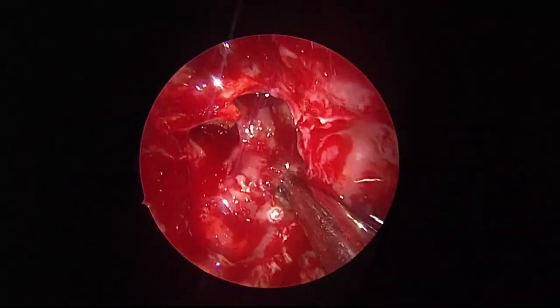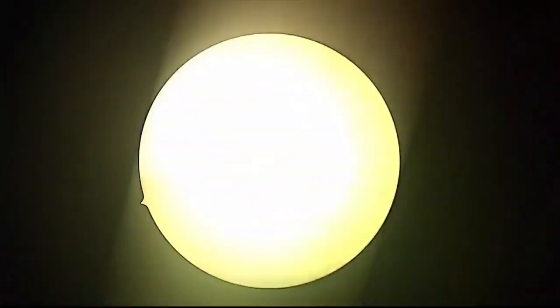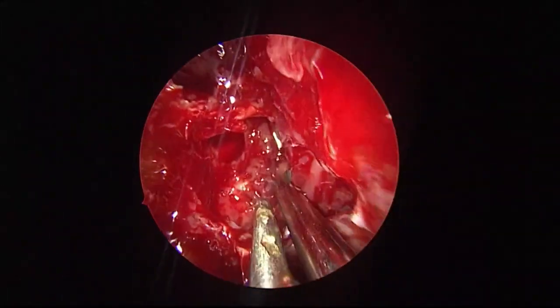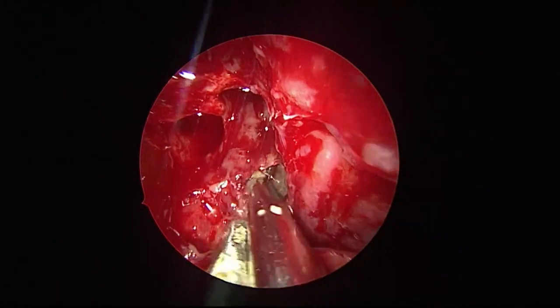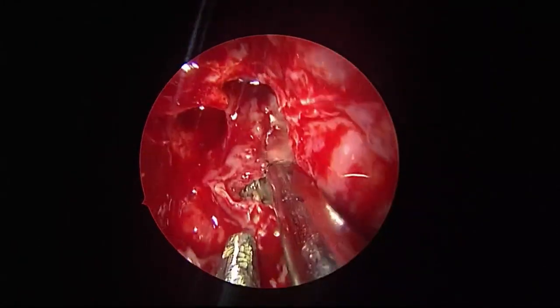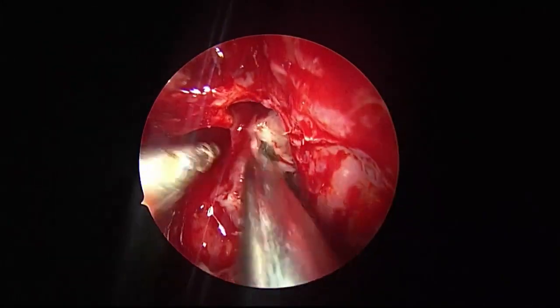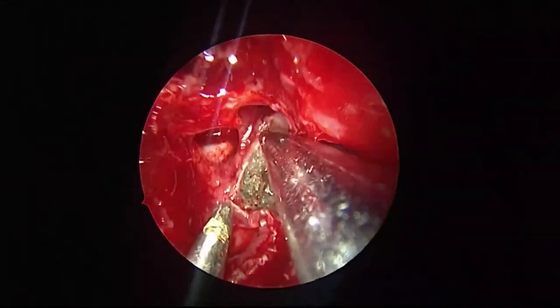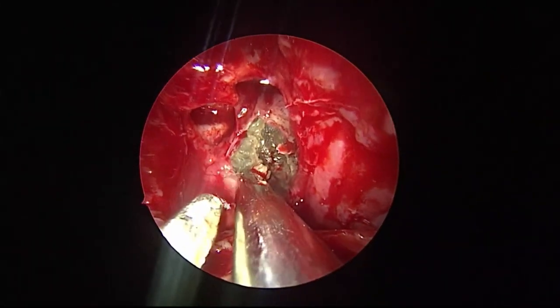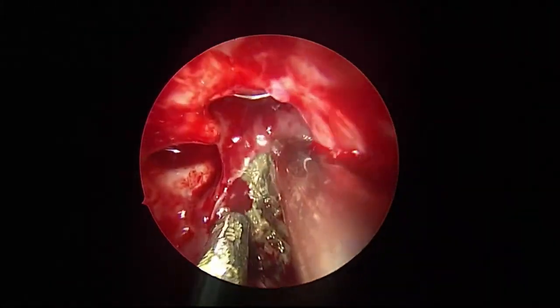Now the last thing left is the sphenoid. See, this is the postethmoid cavity. This is the sphenoid. I am removing the party wall. See this party wall, thinned out because of the disease, because of the expansile nature, compression. I am removing the party wall and widening the sphenoid sinus now, which is jam-packed with the fungus.